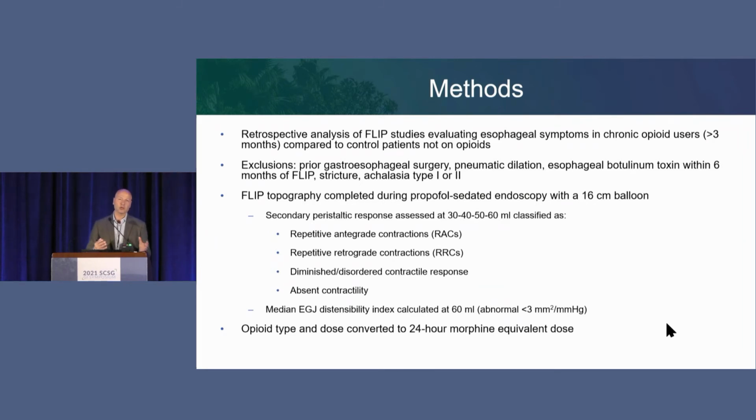And they were specifically looking at these responses, primarily the responses to the volumetric distension. So when you distend the balloon in the esophagus, how does it respond? And if you think about it, it's kind of like a stress test, because your esophagus has to think about, okay, there's something stuck here. What should I do? Well, should I push it into the stomach? That would be the best case scenario. Do I just leave it alone, which is not so great? And the worst case scenario, it pushes it backwards to try to relieve the pressure. So really, what FLIP provides is a stress test for the esophagus.